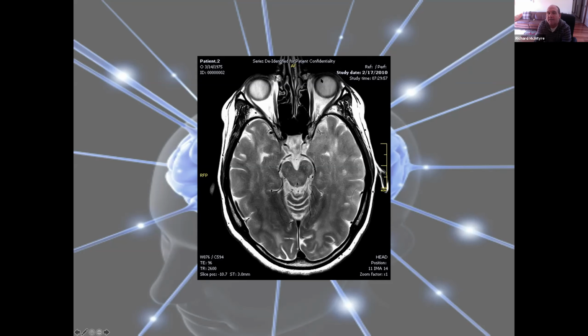That's not wise. Okay, it's much better to say if you can see fluid, it's a T2, because you can see here, this is a T2 scan, but you also see fat. Okay. There are cases where there's a T2 scan and you don't see the CSF fluid. Okay, but again, we'll talk about that. I don't present any of these images here.